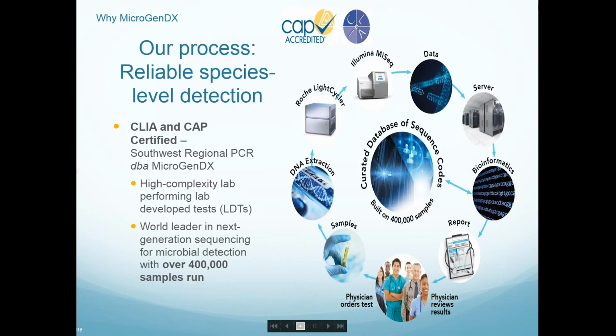Why next-gen sequencing? All right, so the physician orders the test. If you have the PCR available at your facility, you get the initial PCR data back immediately, like within an hour or 2. So you get immediate results, not having to wait a long time. This is the PCR data, it's the quick data. Then you send it to Lubbock, Texas where it goes through next-gen sequencing, and that can take 3 to 5 days once it arrives there for you to get the report back. We are going to go over those reports and how it can help benefit you in your lab.